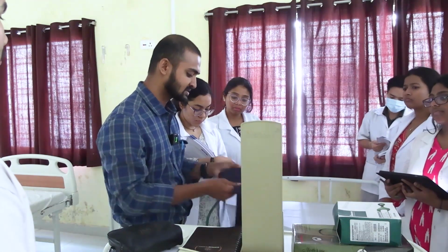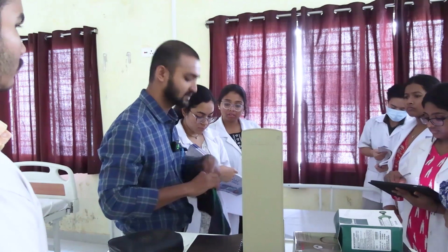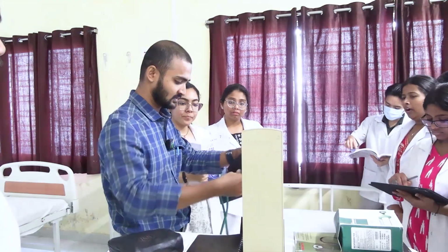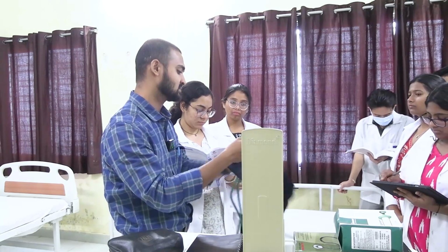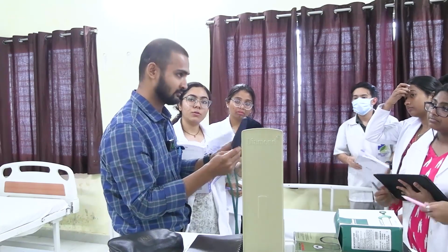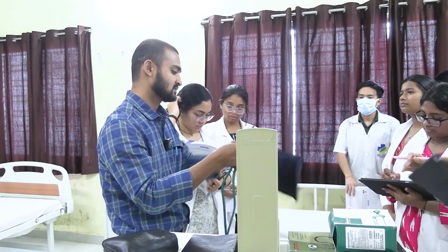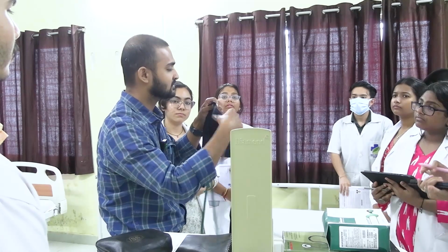And inside the cuff there is a bag. If you can see, there is a bag. The measurement in adults is around 23.5 centimeters in length, and the breadth is around 12 centimeters. From here to here is the length, and from here to here is the breadth.